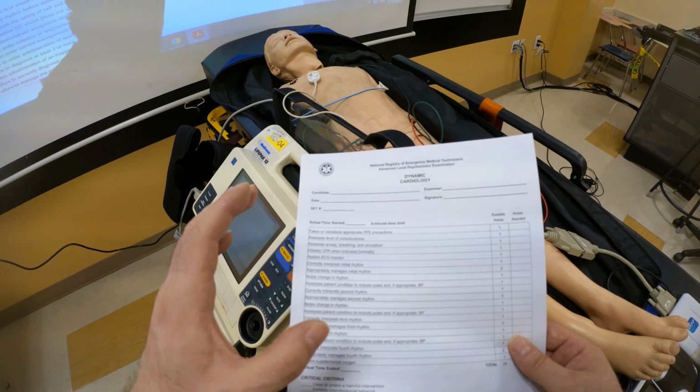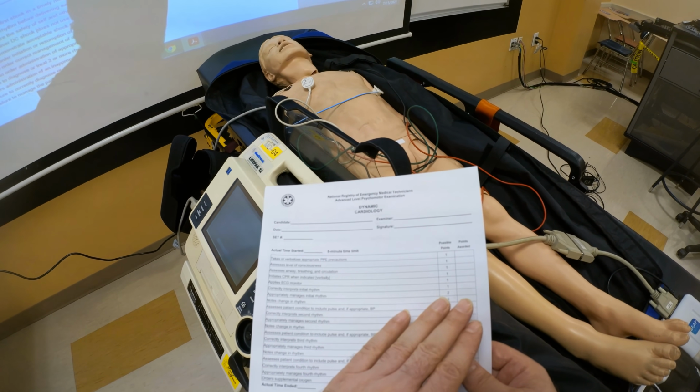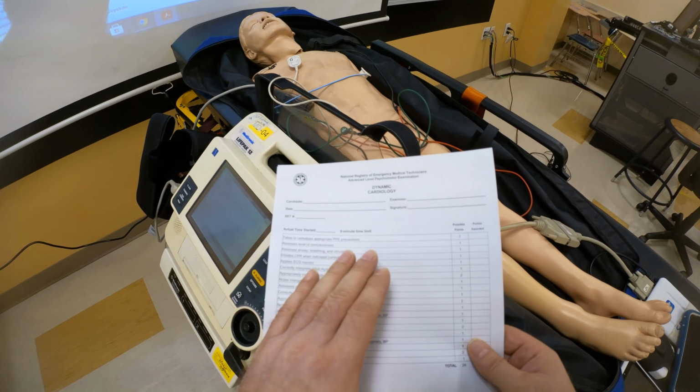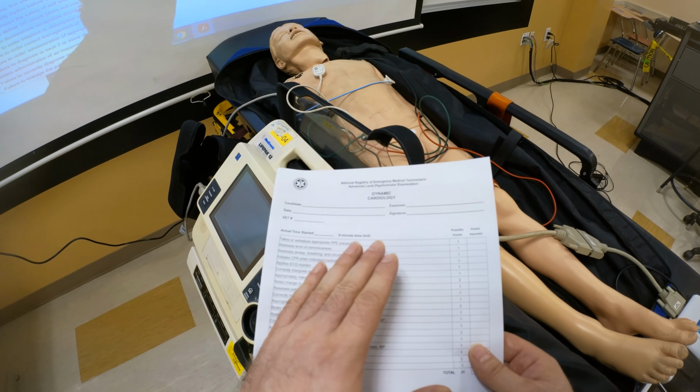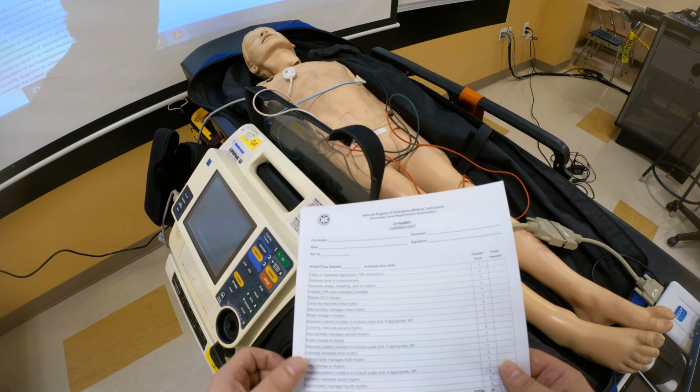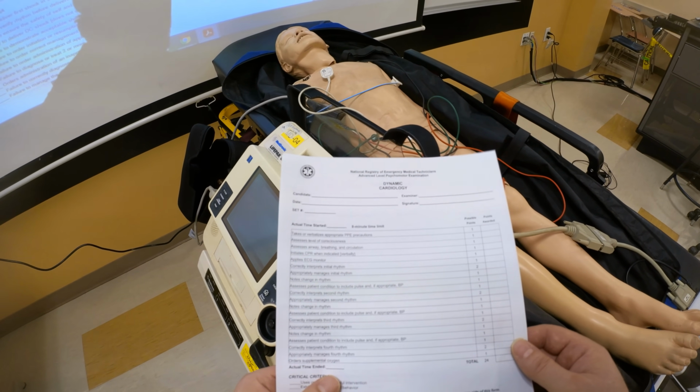So this is the distinction between testing and AHA and real life. In testing, you see a change in the rhythm, you treat it appropriately. In real life, you follow AHA criteria, you run it as per the AHA guidelines, you deliver the shock, and for the next 2 minutes, you're doing CPR and any other therapies. So you need to explain that to the students.